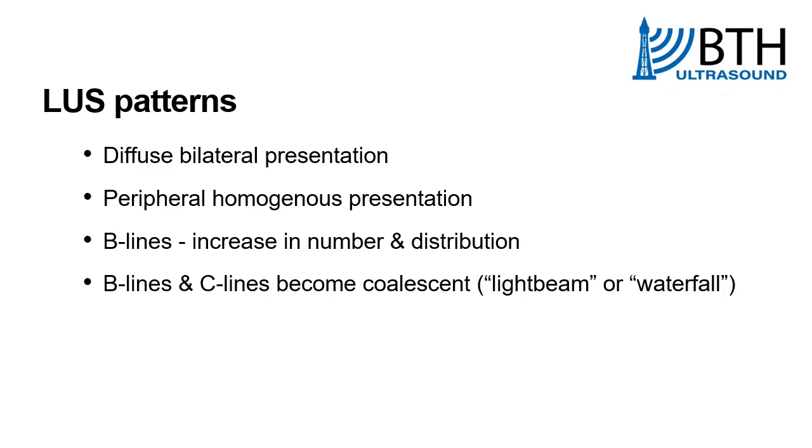In some of the literature from China, you start to hear what's termed the waterfall sign, and the literature from Italy tends to talk about the light beam. So basically this is this very strong coalescent B-lines and/or C-line presentation coming from the pleural level or the subpleural consolidations.